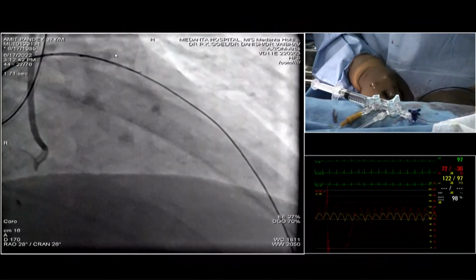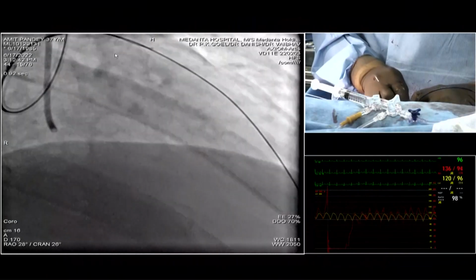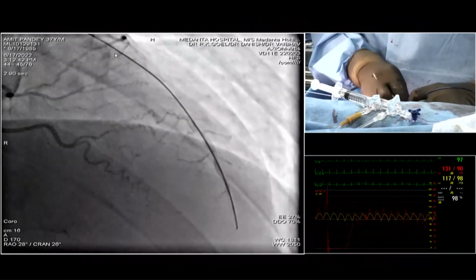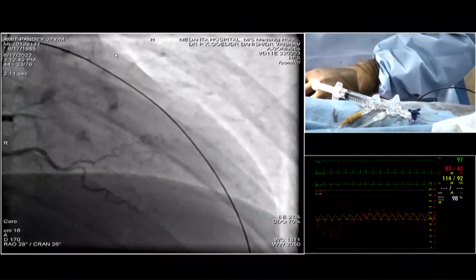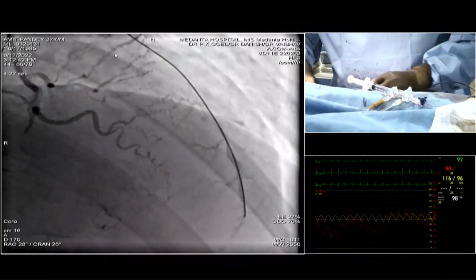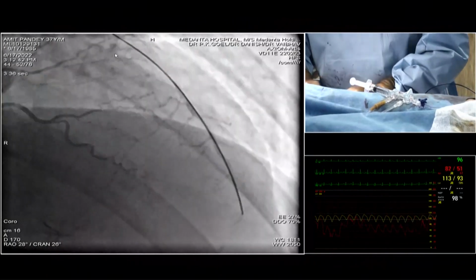And different views of 3D wiring, I always say it's not mathematics. It's like change your views and adjust your tip penetration of the distal cap. This is just 3D wiring, they named it. So that's very important in this case. Don't go by one view and just because it is going smoothly, you will end up in false lumens.